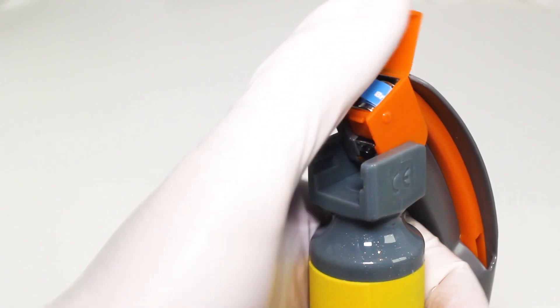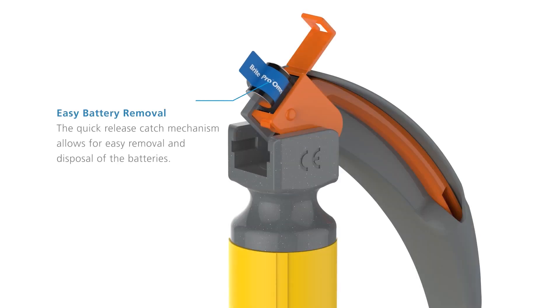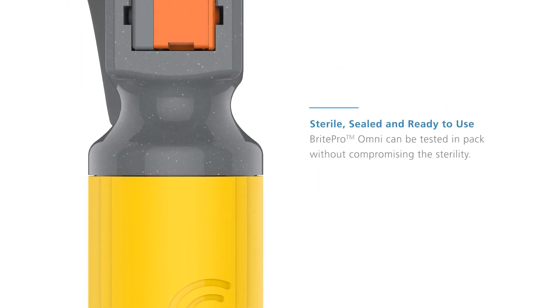The batteries are located in the blade housing. The quick-release catch mechanism allows for easy removal and disposal of the batteries. Sterile, sealed and ready to use, BrightPro Omni can be tested in-pack without compromising the sterility.